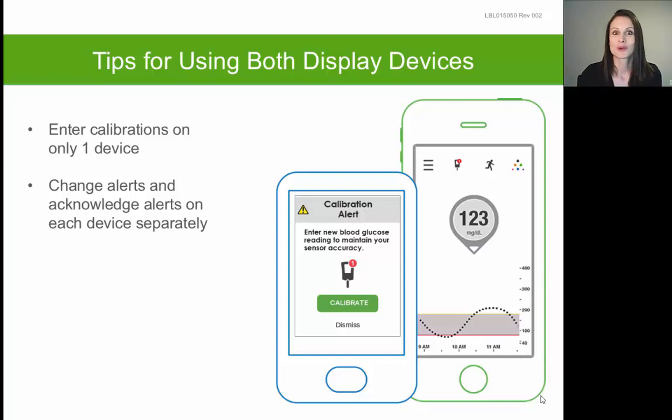If you are planning on using both the receiver and the smart device at the same time, you should only calibrate one device — the calibration will be shared with the other device within about five minutes. When you get an alert such as a high or low glucose alert, you will receive the alert on both devices and will need to clear or silence the alert on both devices separately.